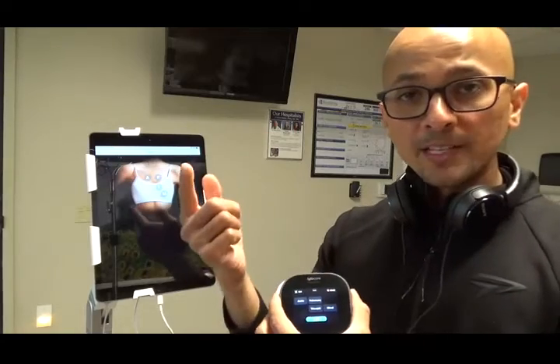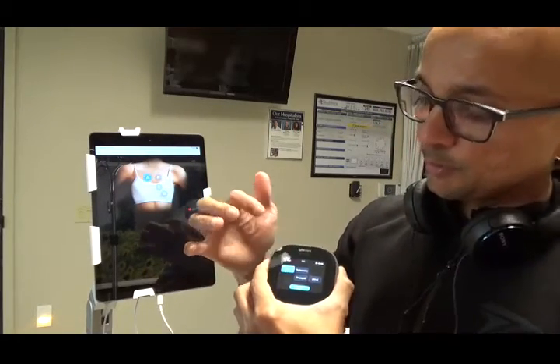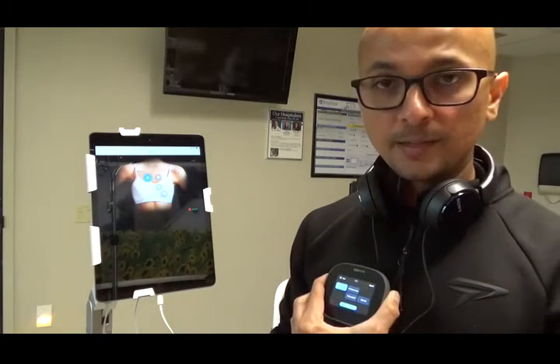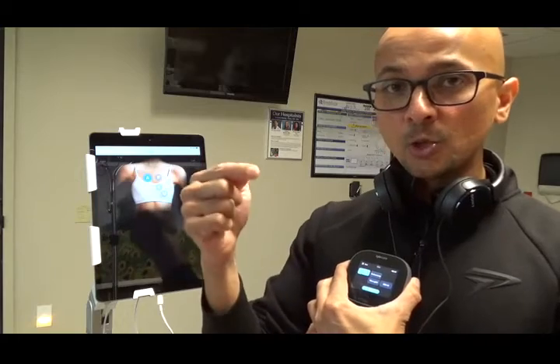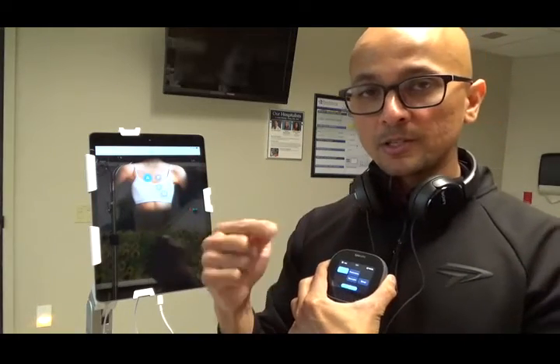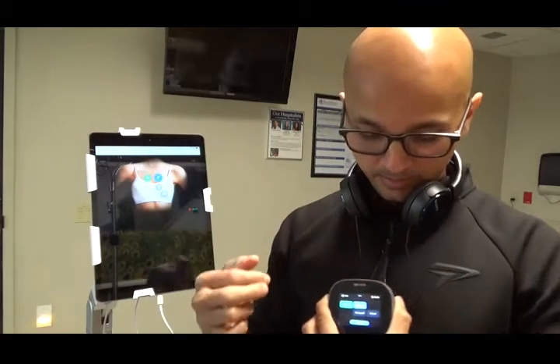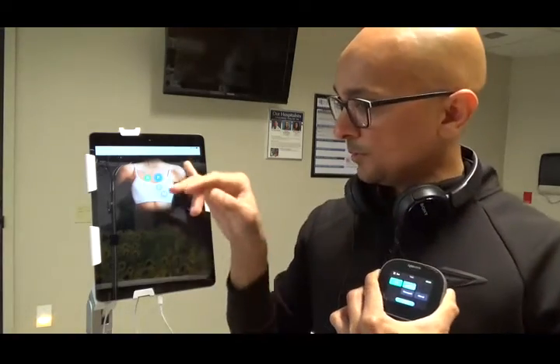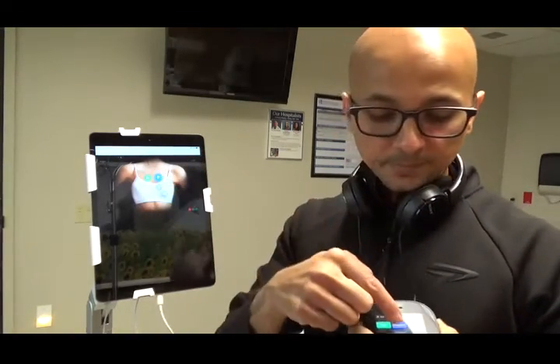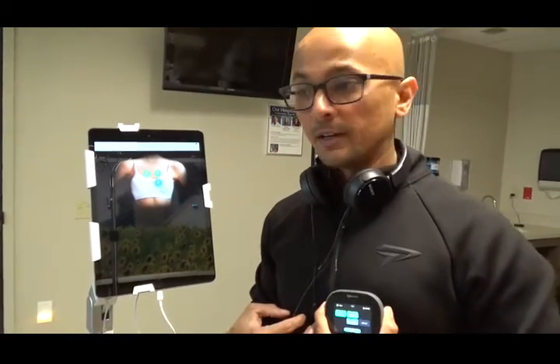So remember, you're forwarding this to the provider. So what you want to do is choose aortic, for example, first, and then auscultate. What this is going to tell the provider is you chose aortic, and whatever they're listening to afterwards is the aortic sound, in that region. Now you choose pulmonic, and you move over, right? Same thing. So now they know what they're listening to. They're listening to this region right there, and you'll do that pretty much for all four spaces.